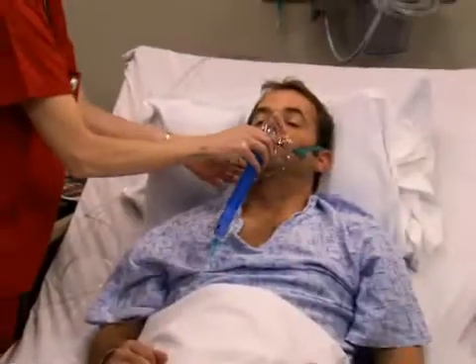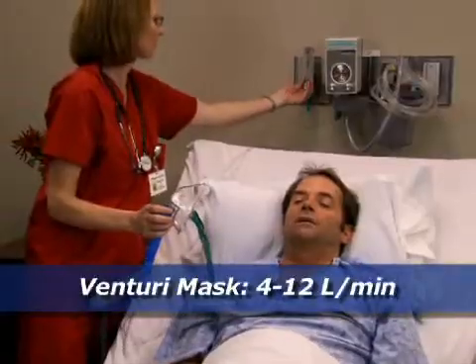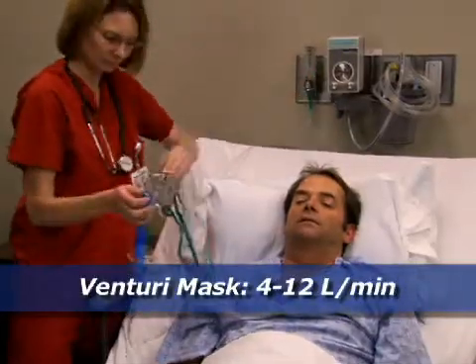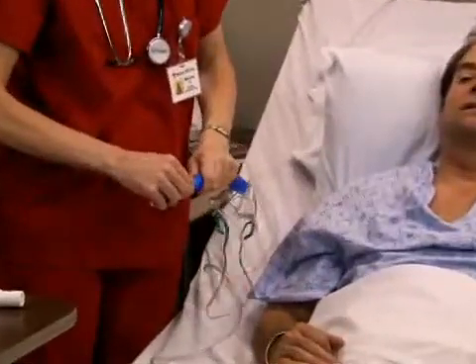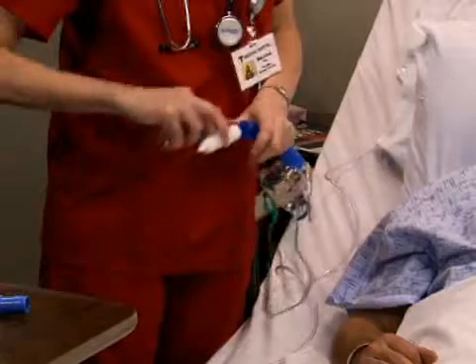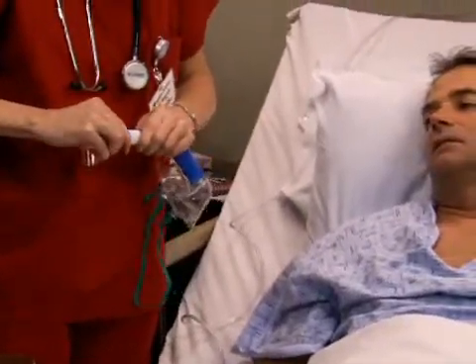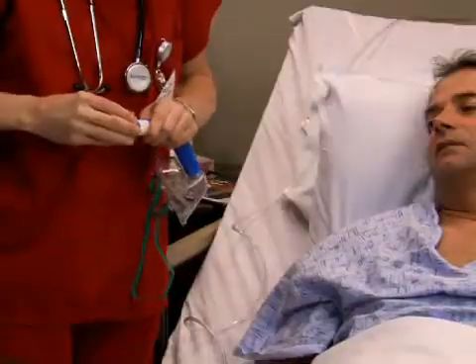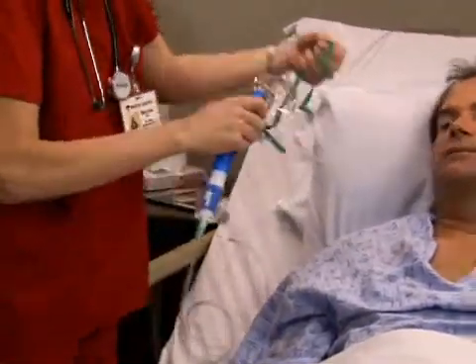For a patient with a Venturi mask, plan to set the ordered flow rate between 4 and 12 liters per minute. Select the appropriate flow rate to deliver the percentage of oxygen ordered by the physician. To deliver a preset FiO2 of 30 to 80%, attach the appropriate color-coded connector as shown. Some Venturi masks include an adjustable barrel instead of interchangeable connectors.